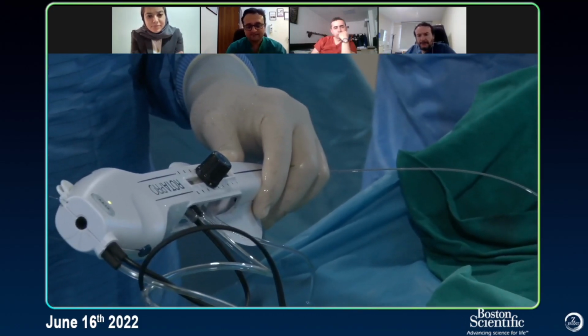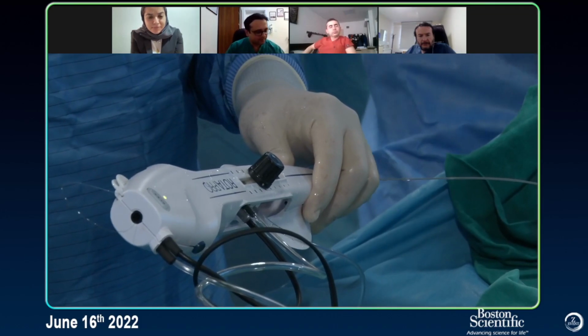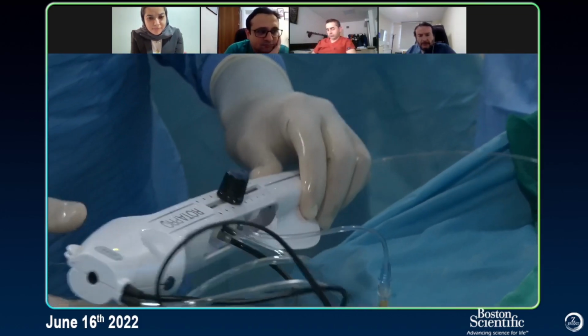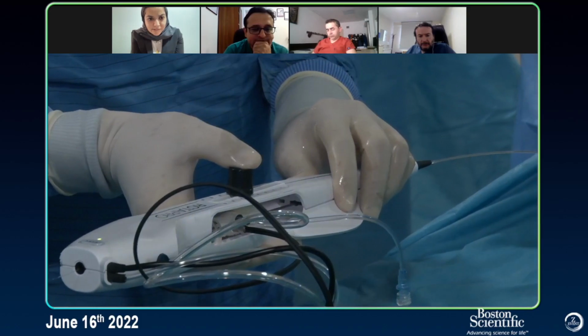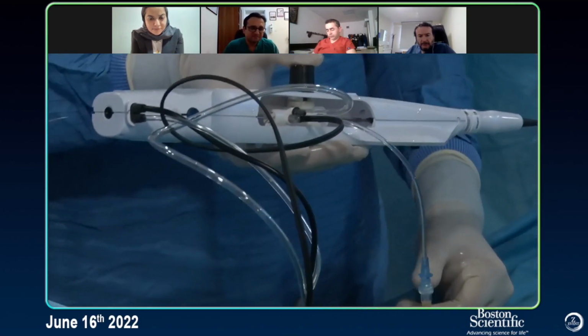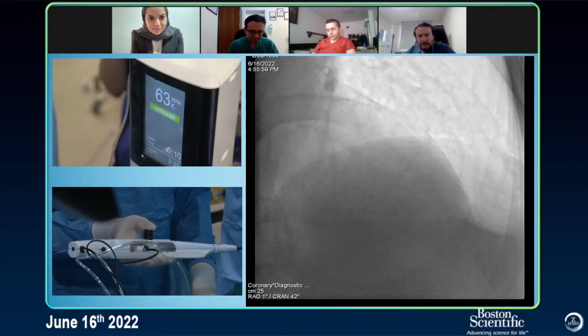It depends a bit. Also, we keep the brake unlocked while advancing the burr. That's important. All right, so we are in the Dynaglide and insert. Go ahead. Now, while it's coming back at the end, you see the proximal. Go ahead.